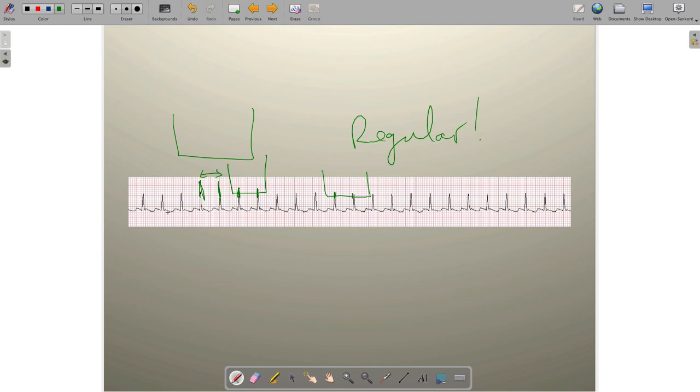So you look at the QRS complexes, you can grab a little piece of paper. They also make calipers to do this. A compass works. You just line up the two points of the compass, or you take your calipers and line them up, or you just take the old method of taking a little piece of paper and just making sure that these things actually march out. So the distance here is exactly the same across. The distance is exactly the same. This is a regular rhythm.